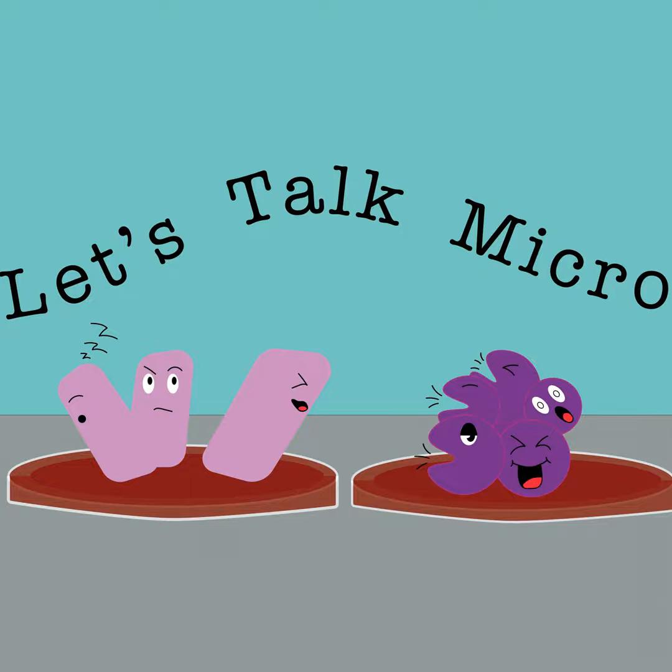And of course, on the benches, you have to work it up. So you need to rule it out. If you see beta hemolytic, you do the proper testing, and it needs to be ruled out. And since Streptococcus A is susceptible to penicillin, you typically do not do susceptibilities unless they are requested. But once you have that ID, you can go ahead and report it. Which is also why instruments like the MALDI are so helpful, because you get those colonies, you put them there, you get that ID, and you're done. No further action is needed as far as susceptibilities.